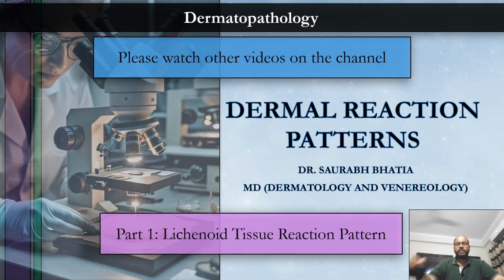Good evening, everyone. So this week we'll continue our lecture series on dermatopathology, and we have already discussed the normal histology of epidermis and the normal histology of dermis, along with the various dermal structures that we usually see in a biopsy. And this week we will continue our discussion, and we will discuss each tissue reaction pattern in a bit of detail so that when we are analyzing these slides or when we are looking at the biopsy report, we are able to make some sense of what is happening.